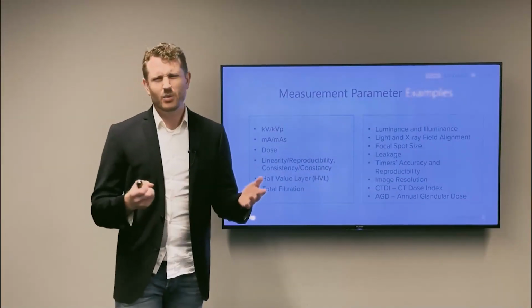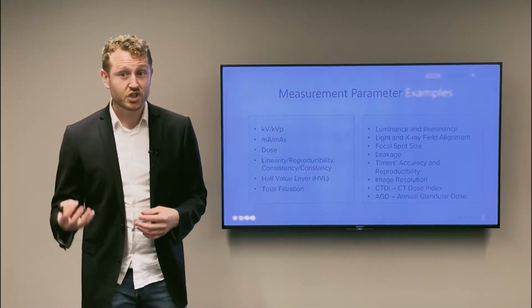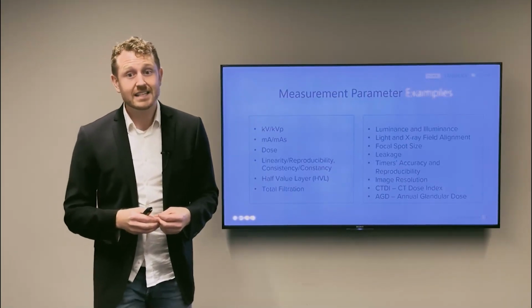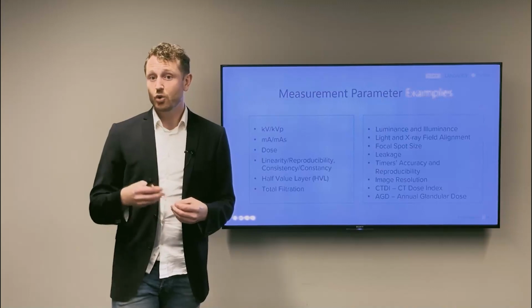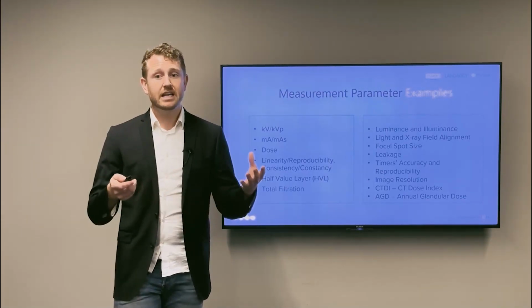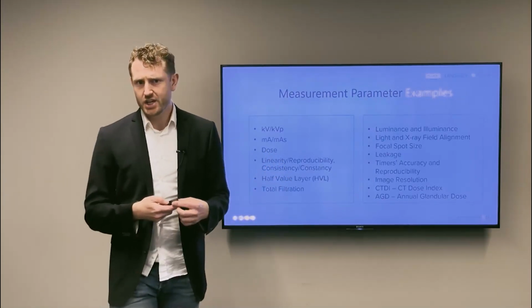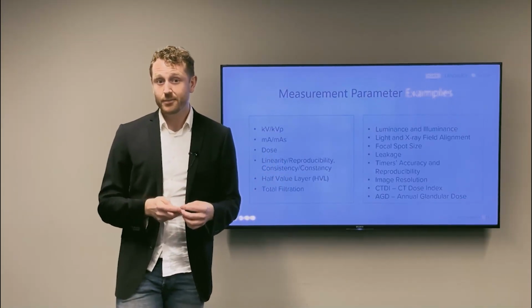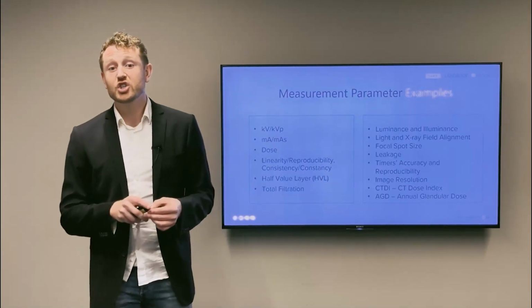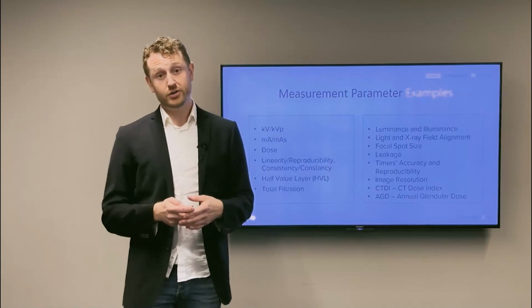Luminance test is something we have not really touched upon yet. This is not related to the machine. Luminance test is made on screens or monitors showing the X-ray image. If it, for example, is too dark in certain areas, the wrong interpretation of the image is at risk. And one does not want the same image to look different on different monitors.